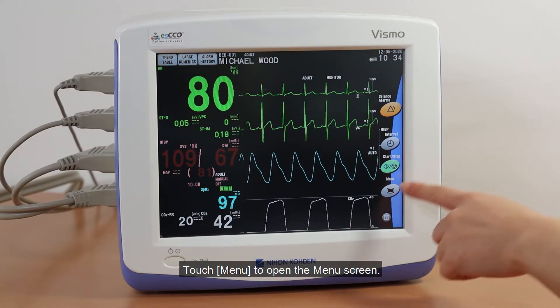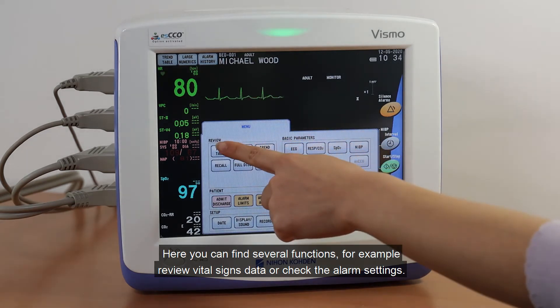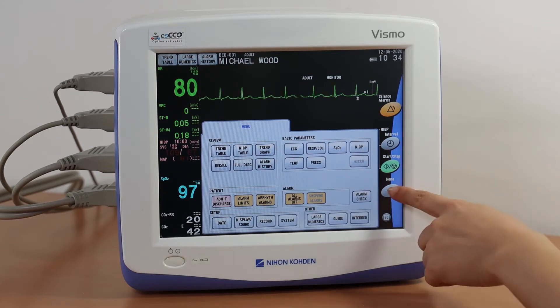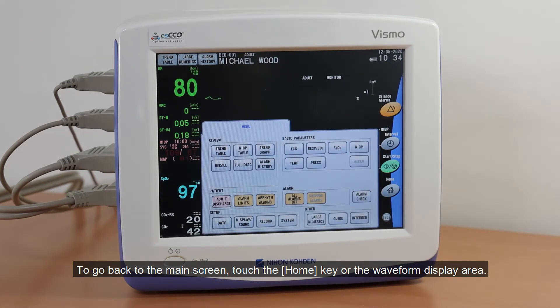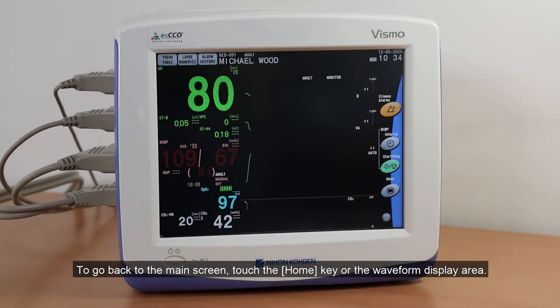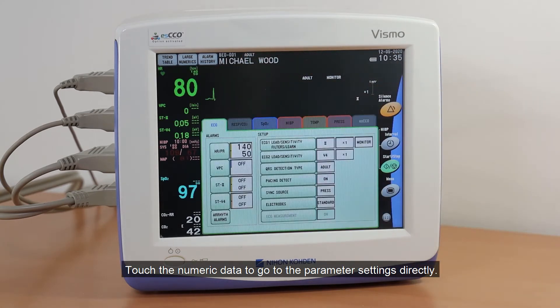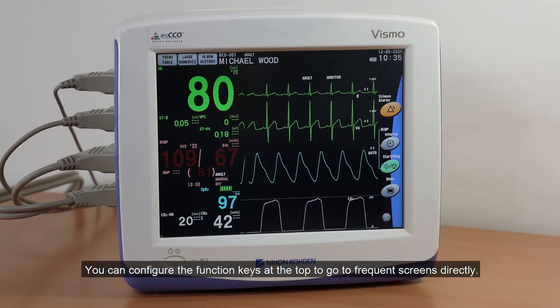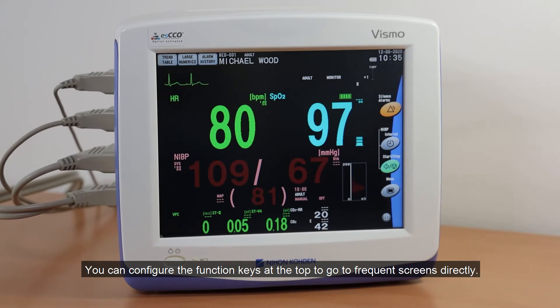Touch Menu to open the menu screen. Here you can find several functions, for example, review vital signs data or check the alarm settings. To go back to the main screen, touch the Home key or the waveform display area. Touch the numeric data to go to the parameter settings directly. You can configure the function keys at the top to go to frequent screens directly.